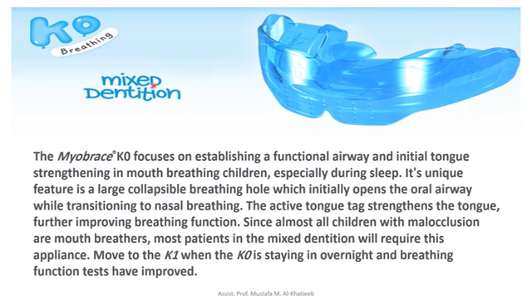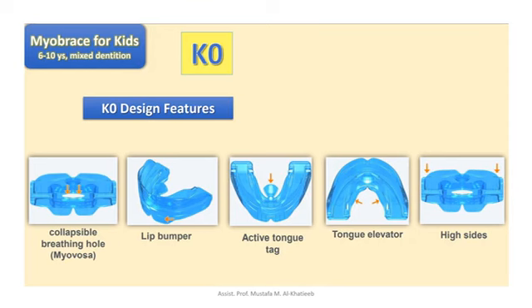So it has a large collapsible breathing hole to change the patient from mouth breathing to nasal breathing.